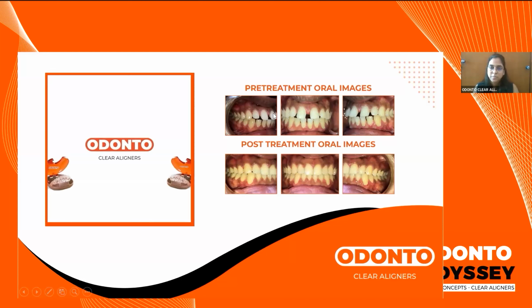You can see there is a lot of spacing present. There is a diastema, a pretty massive diastema, and how you would want to close the space. Now, as a case, this is one of the good cases to start with, because this is a simple space closure, because as we can see, the posterior occlusion is very stable. It is already in class 1.